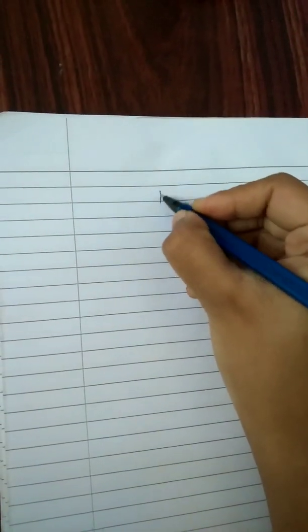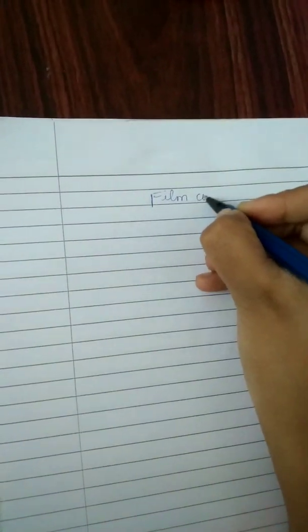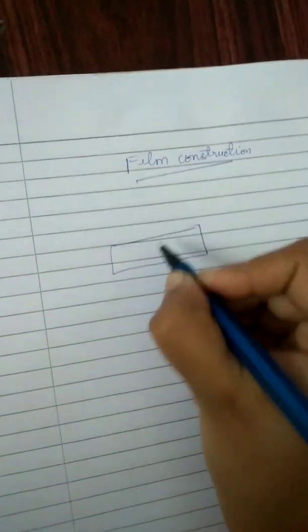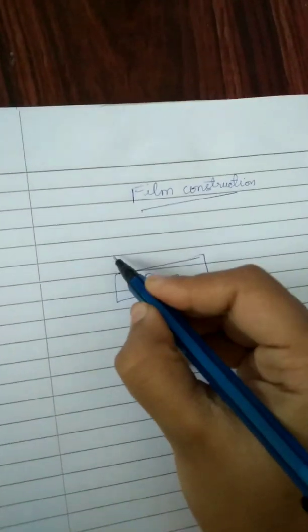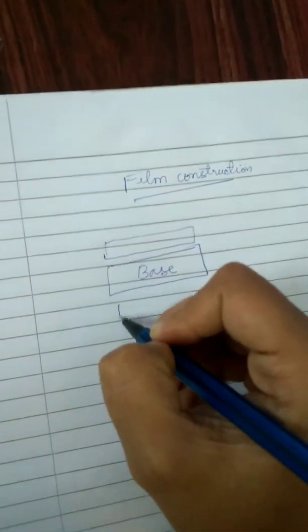So we are going to see construction of x-ray film. Consider the innermost layer of the film is base and there is emulsion layer on top of base.